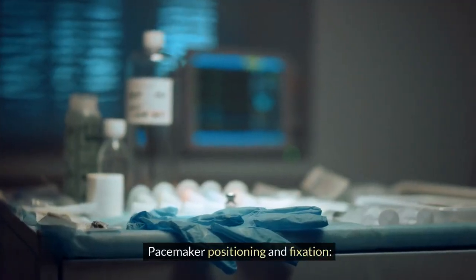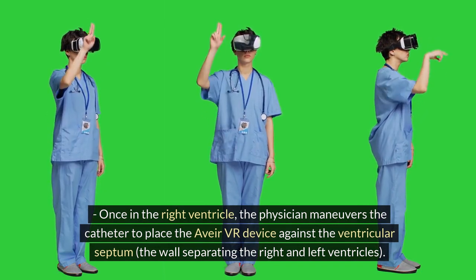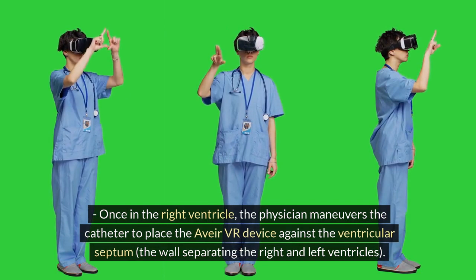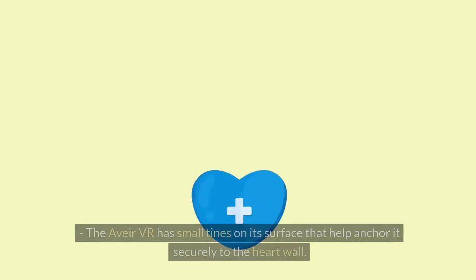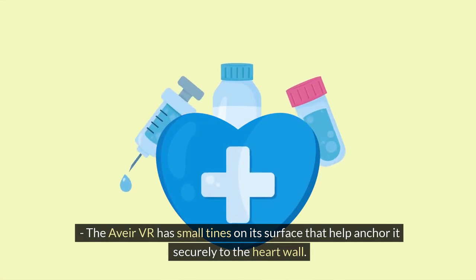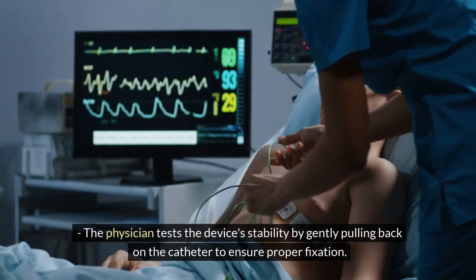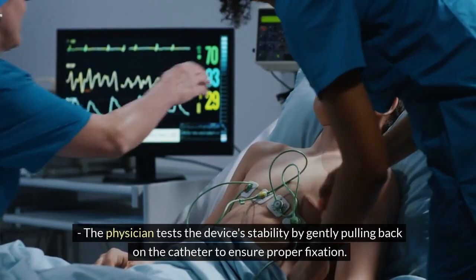Step 4: Pacemaker positioning and fixation — once in the right ventricle, the physician maneuvers the catheter to place the Aveir VR device against the ventricular septum, the wall separating the right and left ventricles. The Aveir VR has small tines on its surface that help anchor it securely to the heart wall. The physician tests the device's stability by gently pulling back on the catheter to ensure proper fixation.